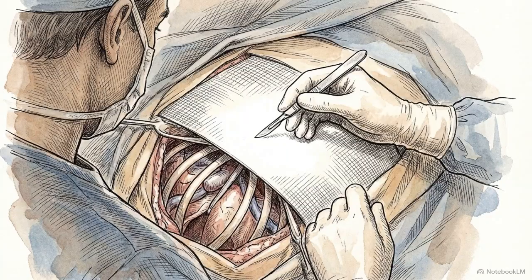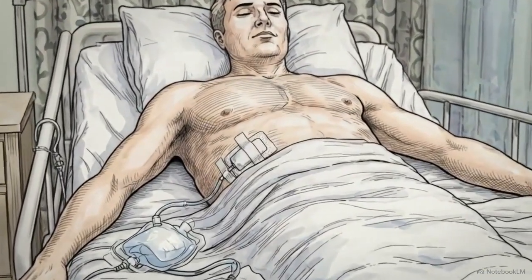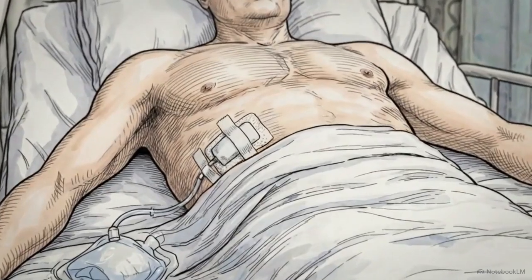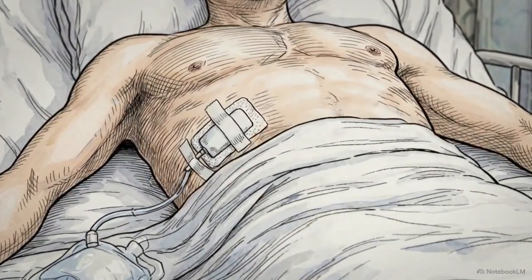Mastering this procedure requires abandoning the instinct to rely on a visual, forceful puncture. By combining precise anatomical knowledge with strict tactile verification, practitioners turn a high-risk thoracic breach into a securely controlled, life-saving intervention.